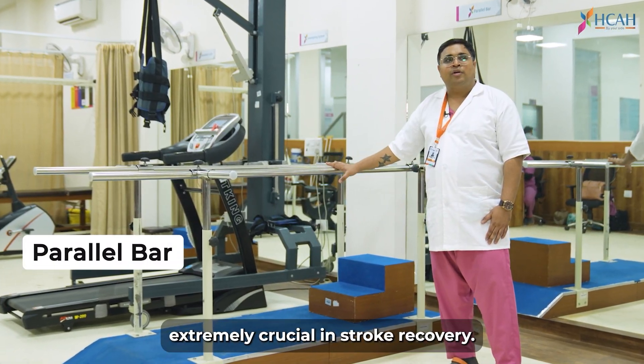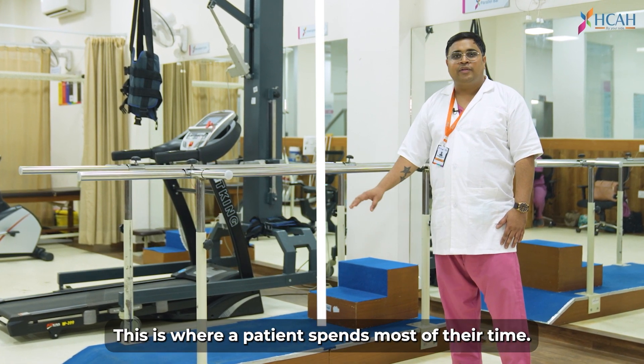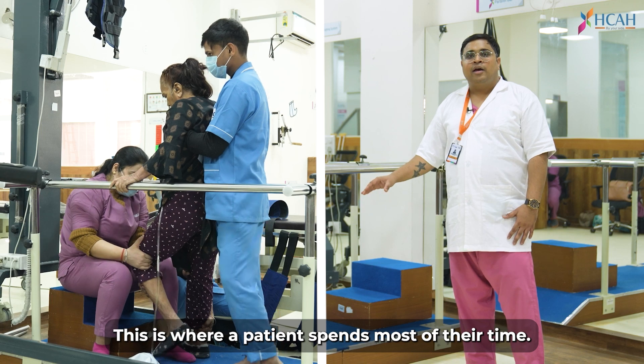This is the parallel bar, which is very important for a patient. You can see that there is also a staircase. This is the place where the patient receives the most important part of their rehabilitation.